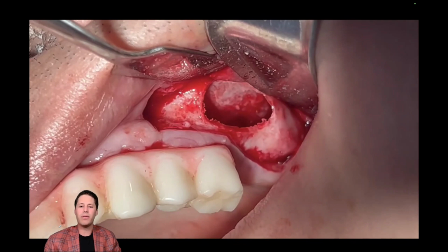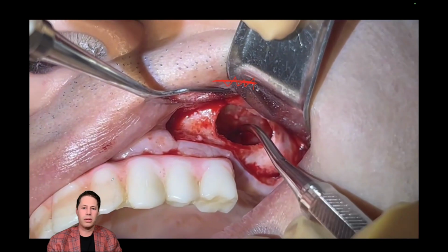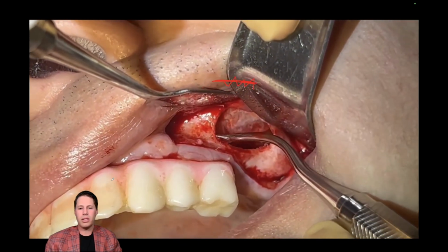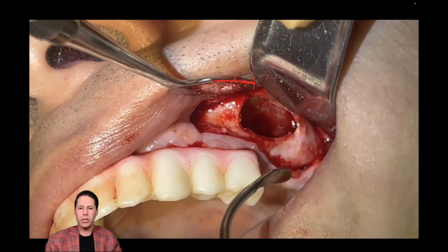You need to be mindful that if you're going to perforate the sinus floor, it's going to happen when you first start lifting the Schneiderian membrane. The most difficult part in terms of lifting the membrane is going to be surgical access along the apical border of the window. So when perforations happen, this is the most common area right here. Let's watch that video one more time here. So you can see maintaining that instrument on bone, again, is really important to do.